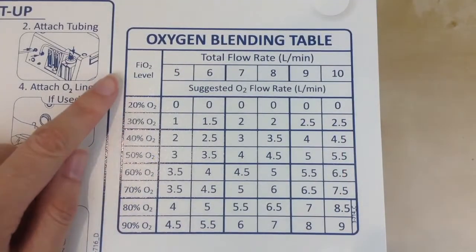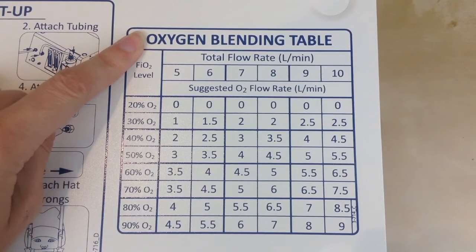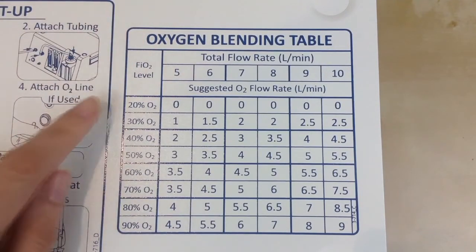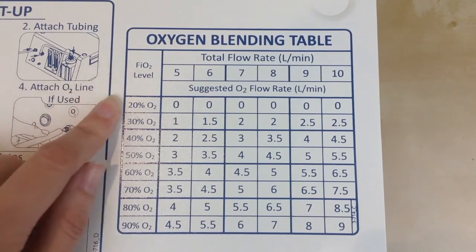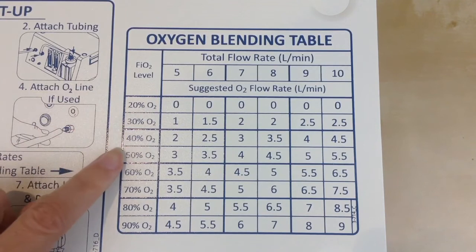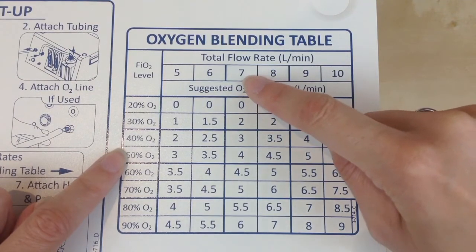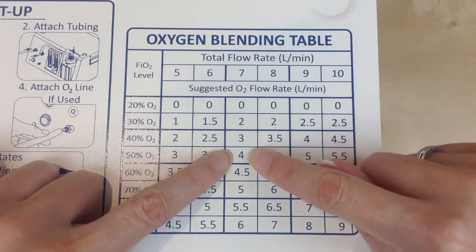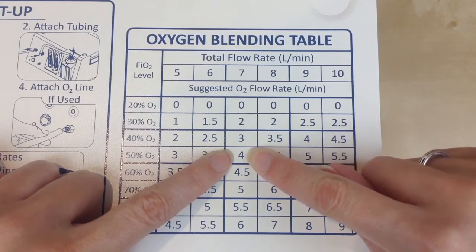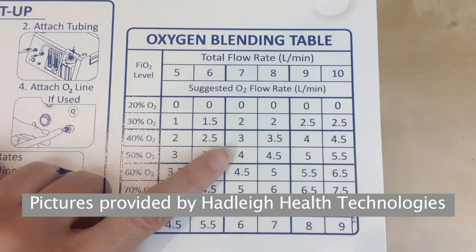If you would like to set other oxygen flow and total flow rates, you can go to the oxygen blending table found on top of the unit. First, you will determine the fraction of inspired oxygen level that you want to deliver to the patient. For example, if we choose 50% FiO2, you then choose your total flow rate, which we will choose at 7, and where these two values meet is your setting for your oxygen flow. So you will set the concentrator or tank to 4 liters per minute, and the total flow rate to 7 liters per minute.